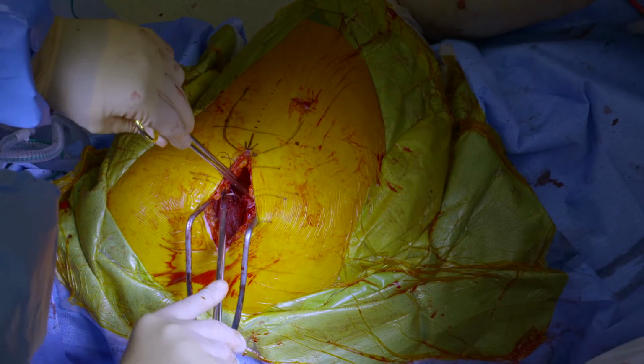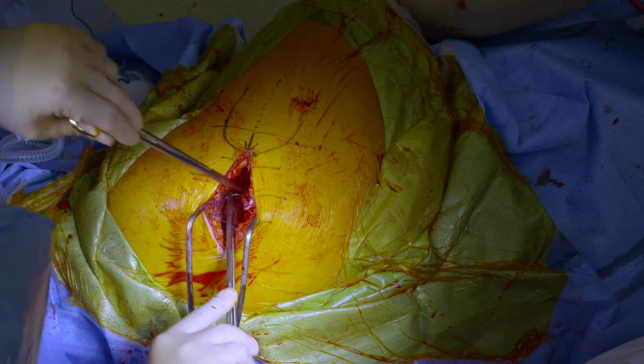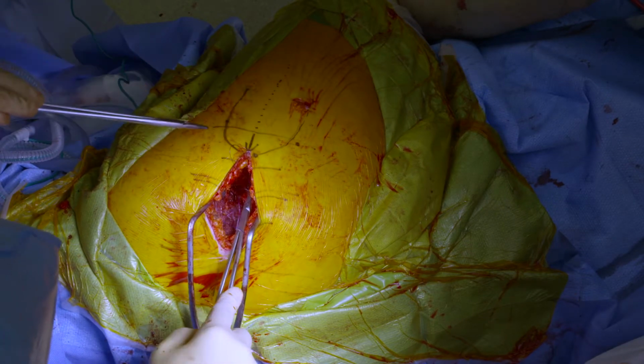Before, when we used the Charnley retractor, which is a type of retractor that pulls the muscles apart, by the end of the case, you take that out and the muscles have tears and it's just traumatizing. Instead, we use techniques that allow you just to very carefully split the muscle fibers apart so you can go through the muscle but not cut anything, and then put in very non-traumatic retaining type of material or retractors that hold it apart. And so at the end of the case, it's a much different situation. The tendons and muscles just fall back together.